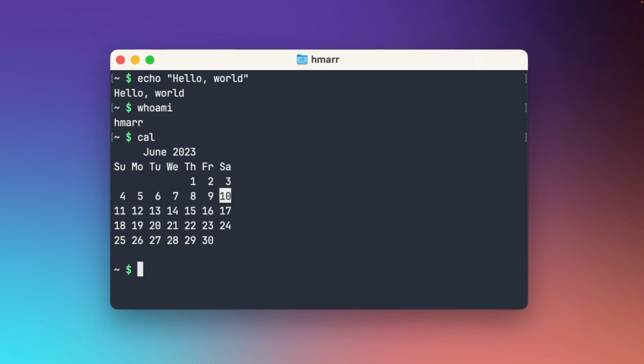It'd be really easy. Secondly, it's really easy for programmers to write programs that speak text, that accept text in and emit text out. Writing complex graphical user interfaces is insanely time consuming. So if you're building a program that analyzes medical data, you want to spend your time as the programmer doing what that program does best, which is the analysis. You don't want to spend weeks and weeks building complex user interfaces, which then need to change every time you add a new feature. So there are just a lot of programs out there that only speak text, that only work via the terminal. So it's useful to get to know the terminal, even if you don't think you'll spend that much time in it.